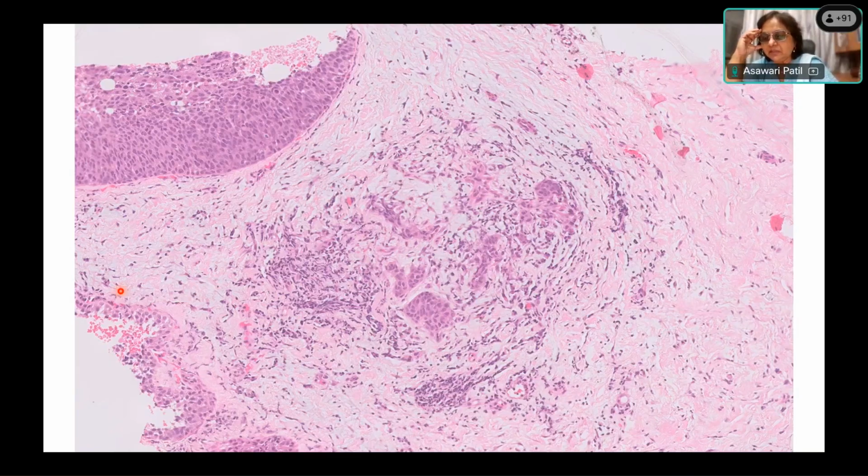Do you think we should measure the size? And how do you measure the size on microscopy? Anyone has any clue? And why is size important? I want some answer from residents.